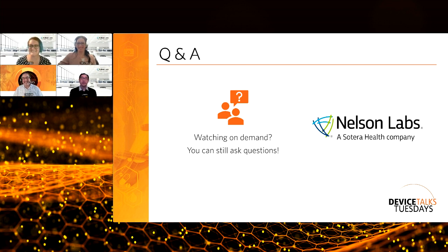It's certainly a good place to start, and it could give you a good idea regarding the risks. But when it comes down to it, regulatory bodies want to see testing on the finished good or have a really good rationale as to why you didn't. Normally when they make those claims, like it's medical device grade, any kind of testing they did was just on, say, coupons or pellets. It's just in their raw form. Sometimes they're not even sterilized before testing.